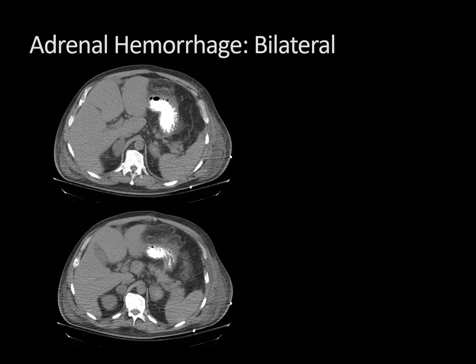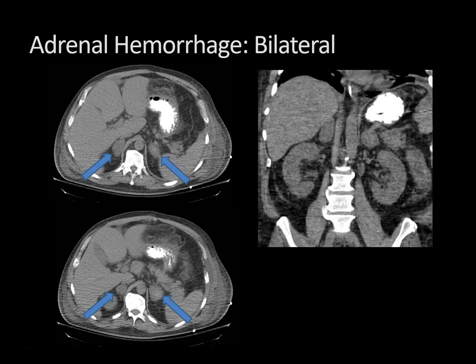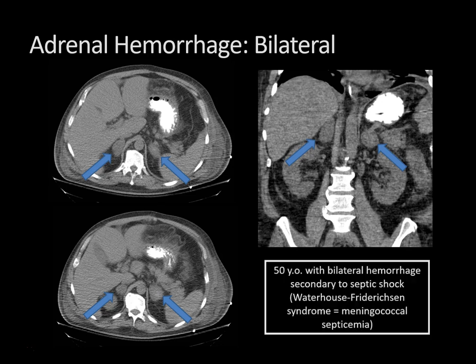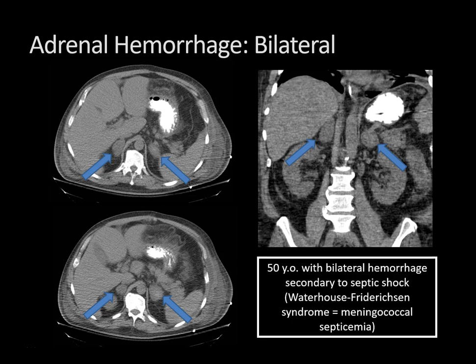Let's look at another case. You can see bilateral adrenal masses, so right away you're thinking this is likely non-traumatic adrenal hemorrhage since it's bilateral. The coronal image also shows bilateral mildly heterogeneously hyperdense adrenal masses just superior to the kidneys. This was a patient with Waterhouse-Friderichsen syndrome — bilateral adrenal hemorrhage secondary to meningococcal septicemia, an infectious process that can lead to shock and massive hemorrhage into both adrenal glands. It's also characterized by hypotension and can evolve into disseminated intravascular coagulation (DIC), so important not to miss this.